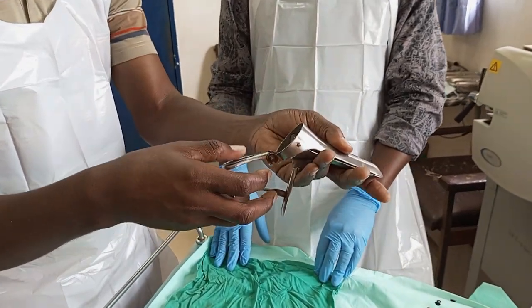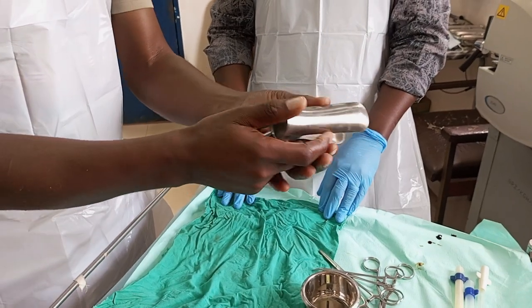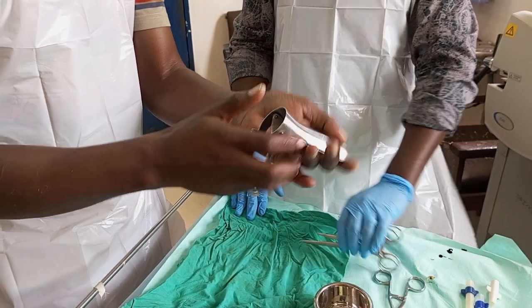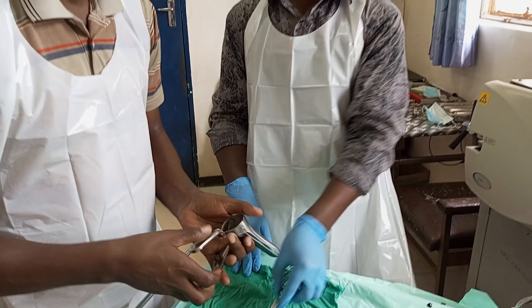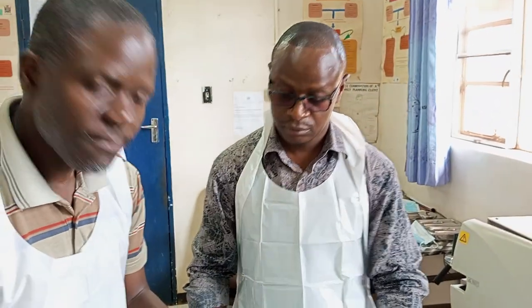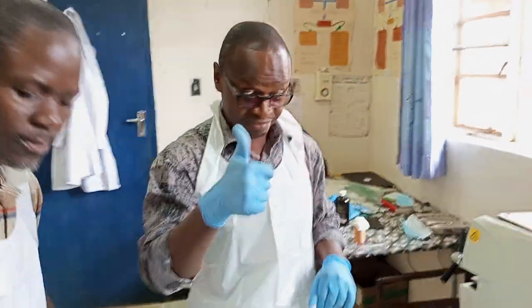When we use an instrument on the patient, for example this speculum, which goes into the vagina, we cannot just be using it from one patient to another, meaning that we're going to introduce infection. So we need to autoclave it. We're going to use the machine. I'm here with Mr. Chibuye, who's going to demonstrate to us how we use the autoclave or the sterilization machine. Mr. Chibuye, the floor is yours. Thank you, sir.